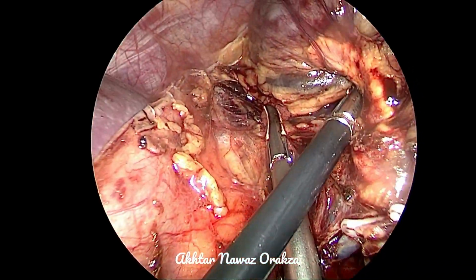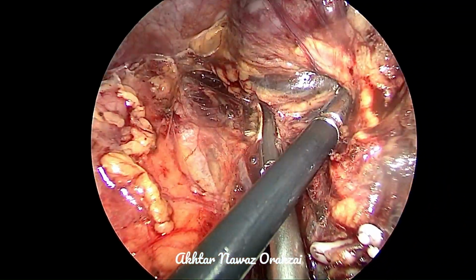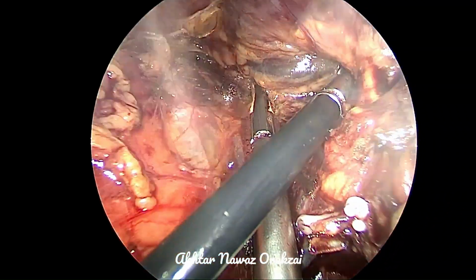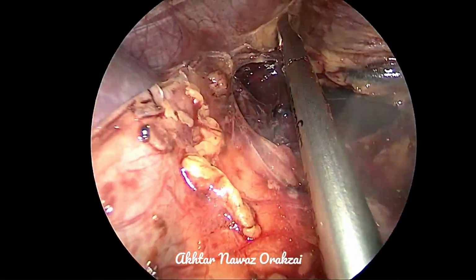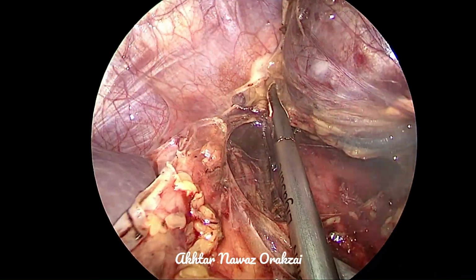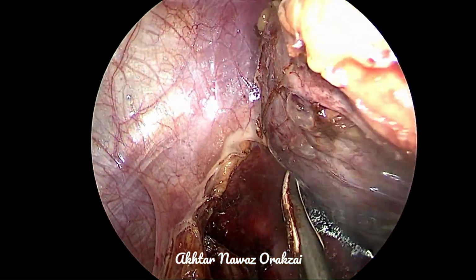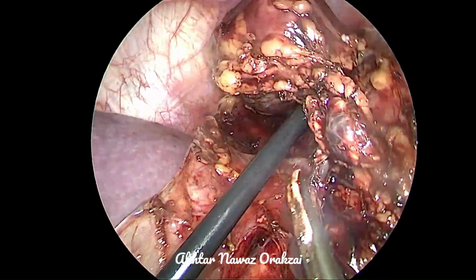These are small vessels, and we can also see that there is a small vessel coming to the adrenal gland, most probably the inferior phrenic artery. Branches from the inferior phrenic artery to the adrenal gland. Here.